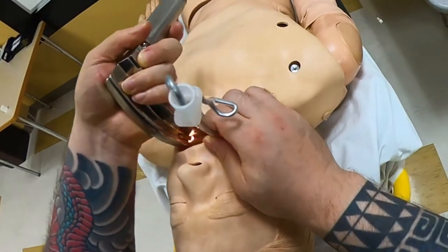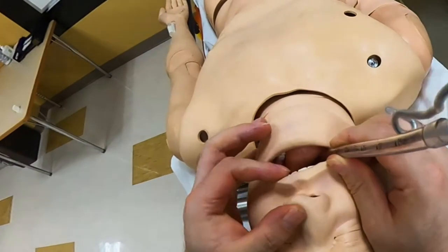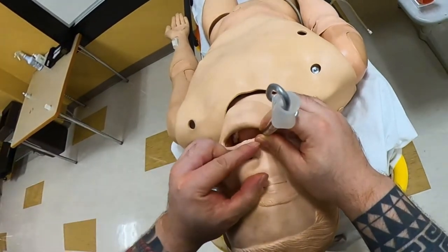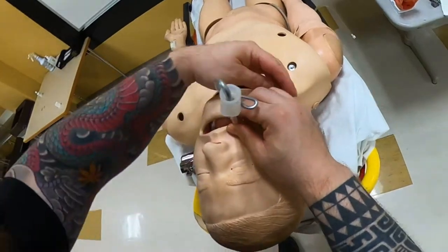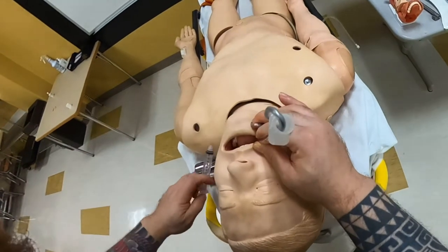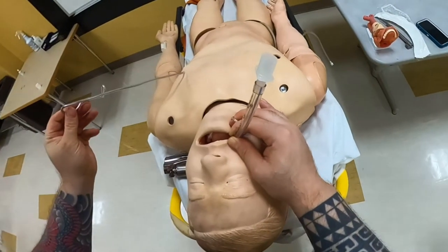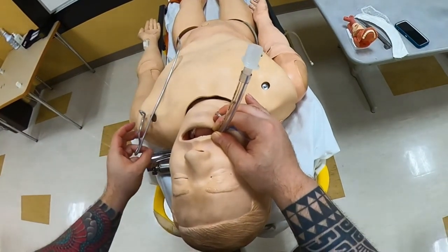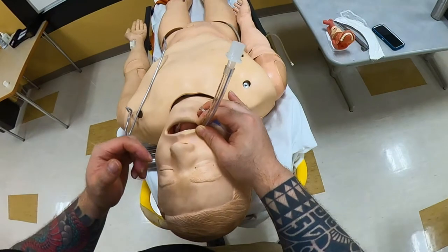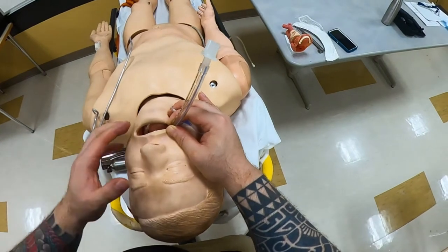Once you're in position, note depth — ideally you want to be at about 20 at the teeth. Anchor your thumb to the maxilla, then inflate the cuff. Always keep the tube anchored in case someone pulls it too aggressively, so the tube does not get dislodged. You went through a lot of steps: positioning the head, positioning the patient, finding landmarks. That's why you always anchor the tracheal tube and never let go until it is secured.